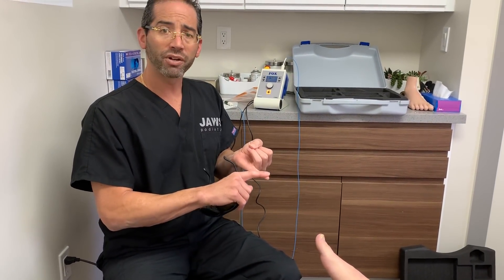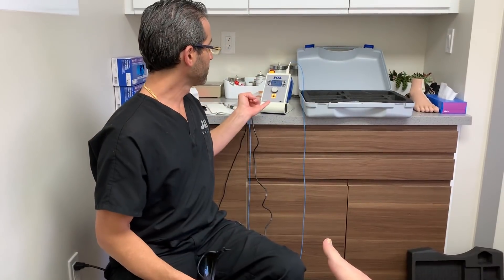Newer's not always better. We use laser as an alternative, and we also have something called the Pathformer — it's the only robotic micro-drill in the state of Florida. We're the only office that actually has that machine.